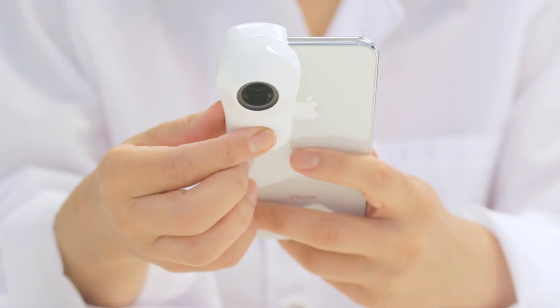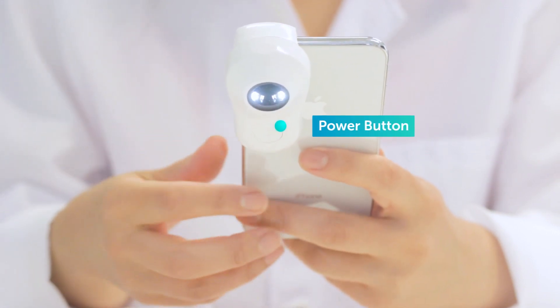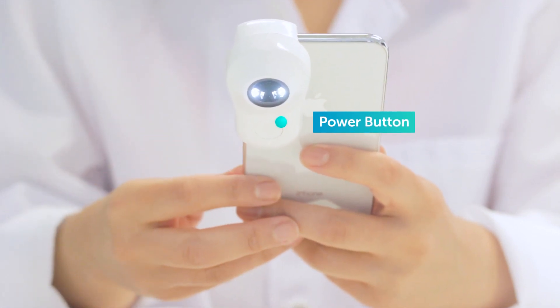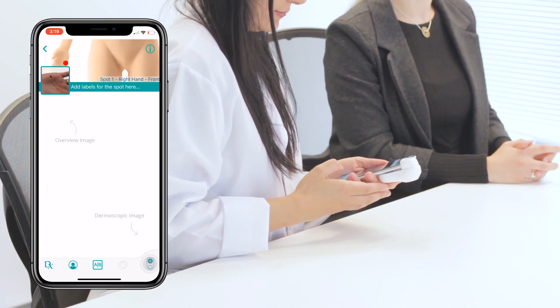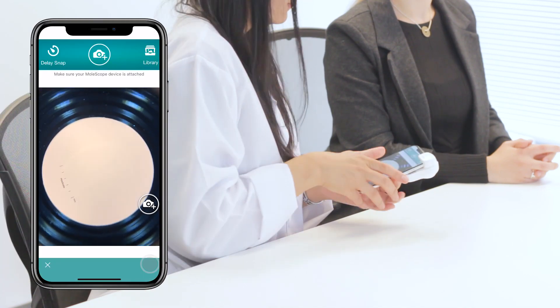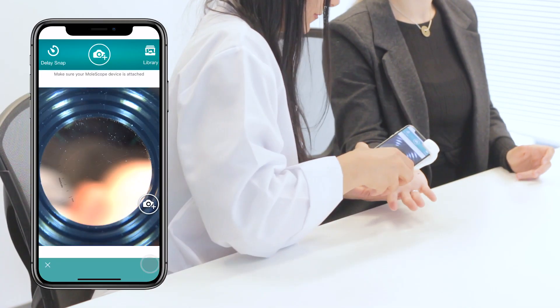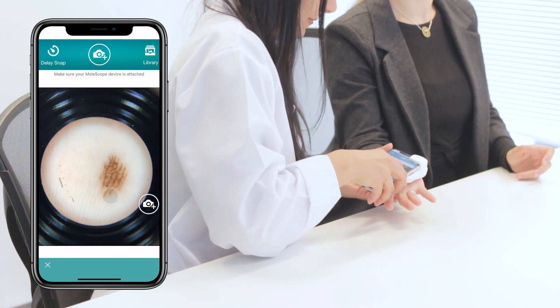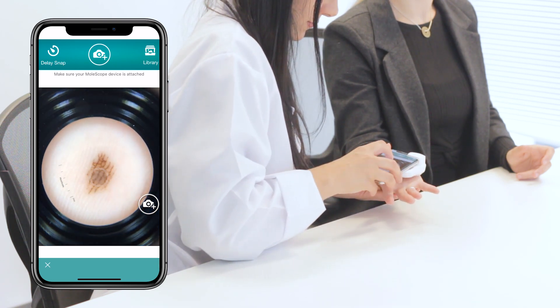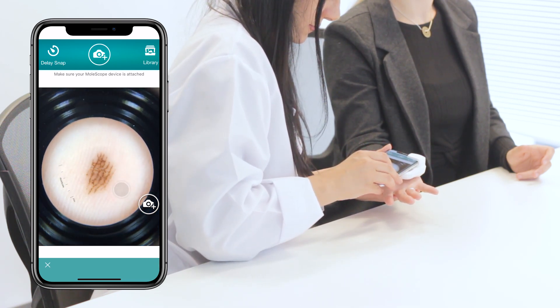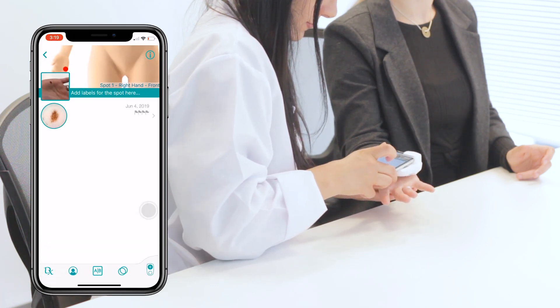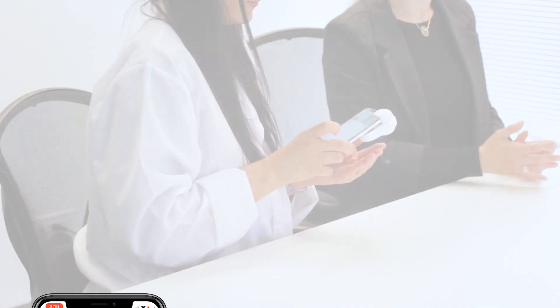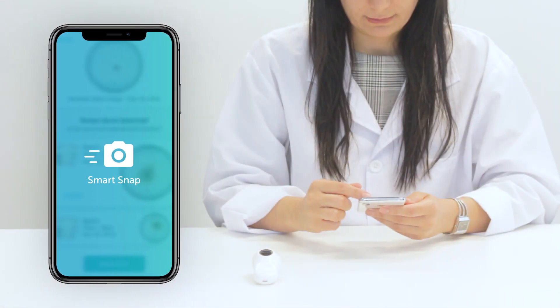For the best imaging quality, make sure your phone and device's lenses are clean. If you're using a molescope, be sure to turn on the light by pressing the button. Next, tap the dermascope icon, and remember to tap to focus on the spot. I'll now show you another imaging workflow for fast follow-up appointments: SmartSnap.